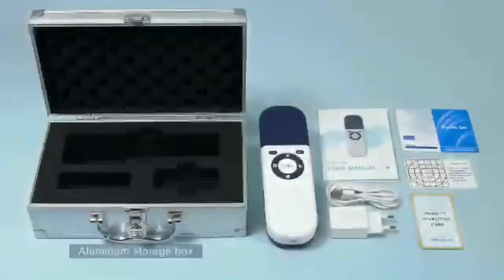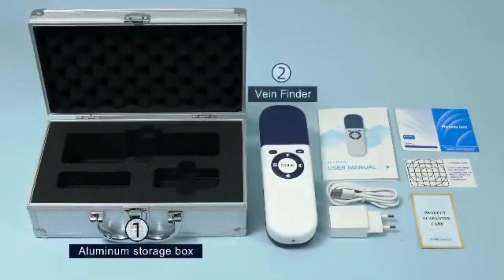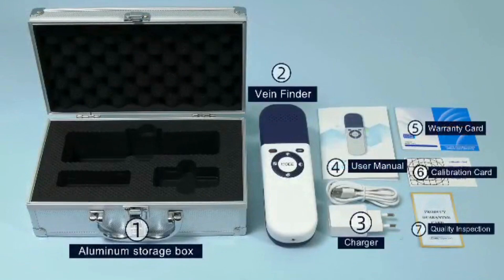The standard configuration consists of aluminum storage box, VeinFinder, and charger.